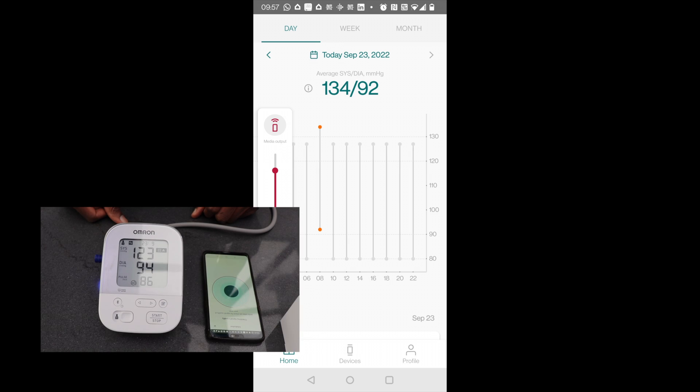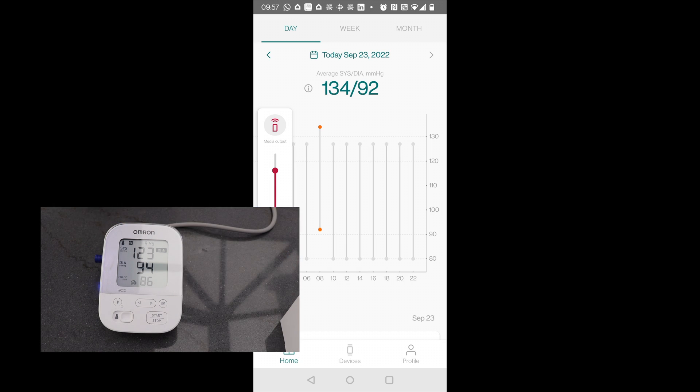The reading from my blood pressure monitor and the reading from the Atcare wristband are not extremely far off, especially when you consider that I was busy filming at the same time. So I think the gap is kind of understandable.